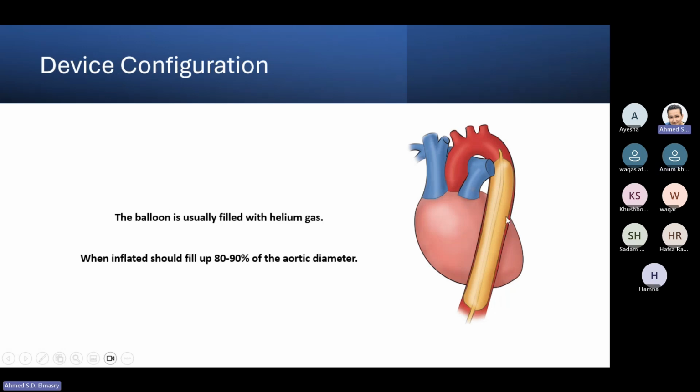The diameter of the aorta, or any artery, will be increased because the vasomotor tone will be reduced. So you will have the state of vasoplegia, which causes more dilatation. The intra-aortic balloon will achieve its maximum inflation, but actually the aorta is dilated because of sepsis.